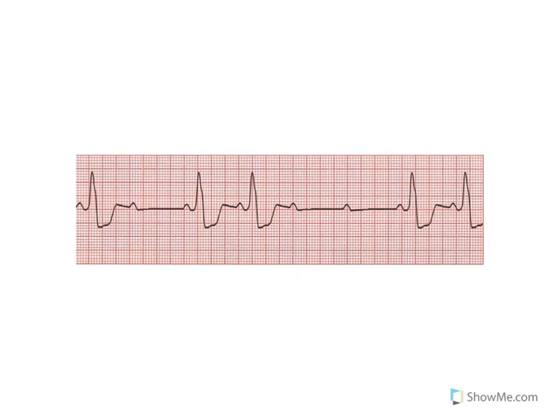Identify it using the PR relationship, the relationship between the P wave and the R wave, okay? As you can see here, look at that PR interval, very nice. It's even within the 0.20 seconds. Those PR intervals are great, no problem.